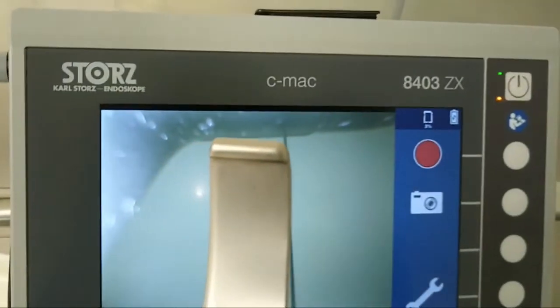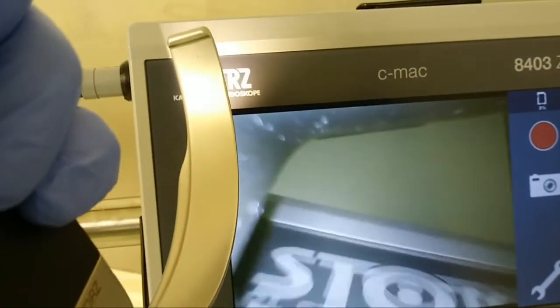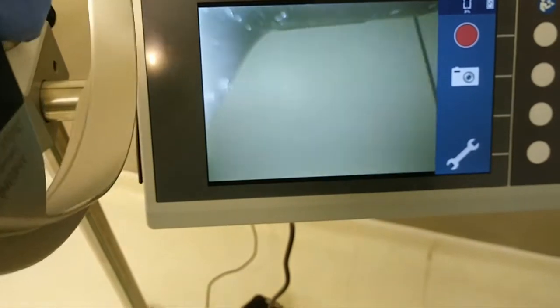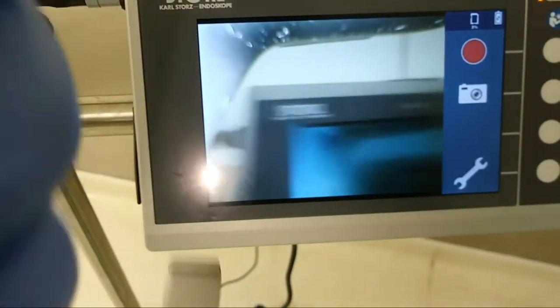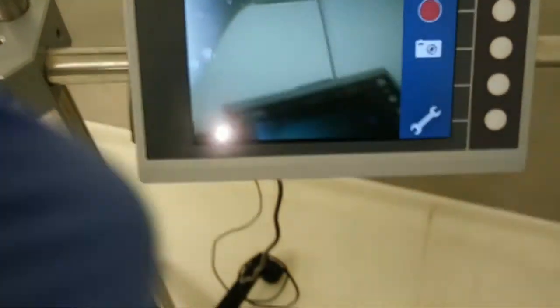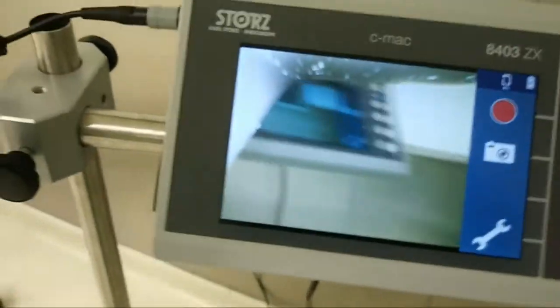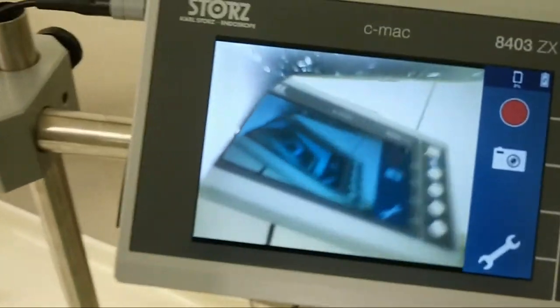We can capture video and pictures in two ways. One is with the handpiece, where there is one button. We can use this, or otherwise we can use the recording button and capture button on the monitor. Through the settings, each monitor has a demo video in its memory. We can see the demo video, and we can also use previous videos and captured pictures for future research and studies.